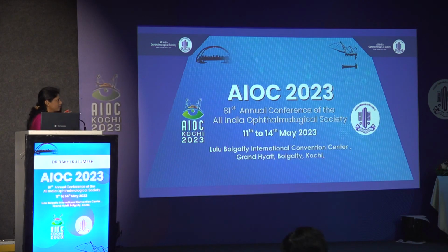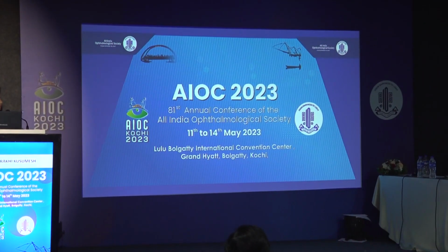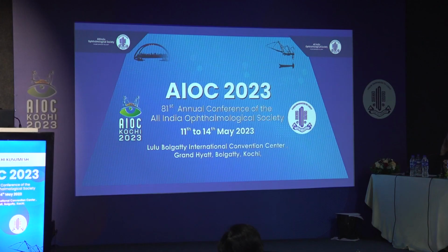I would like to do it in those patients who have very hard cataract, brown cataract, and any patient who has undergone cataract surgery with corneal decompensation in one eye, then the other eye must be evaluated. In these cases, it is mandatory. The last one, the patient with a decompensated cornea in one eye, these are the patients who are very crucial. Exactly. So thank you, Dr. Rakhi.